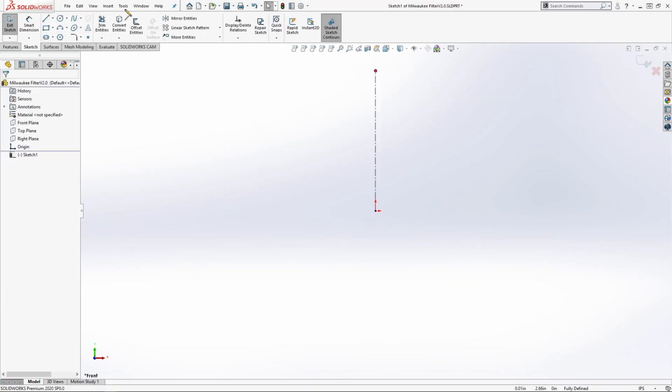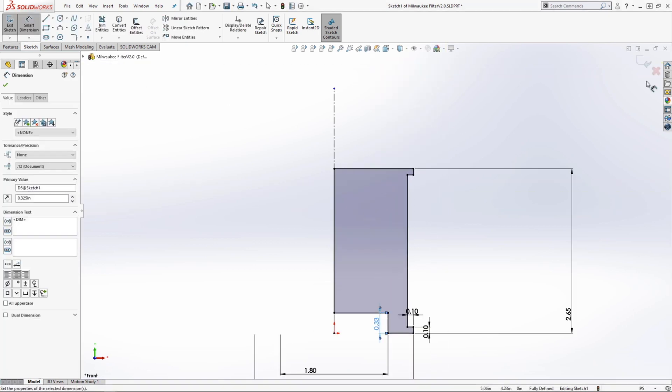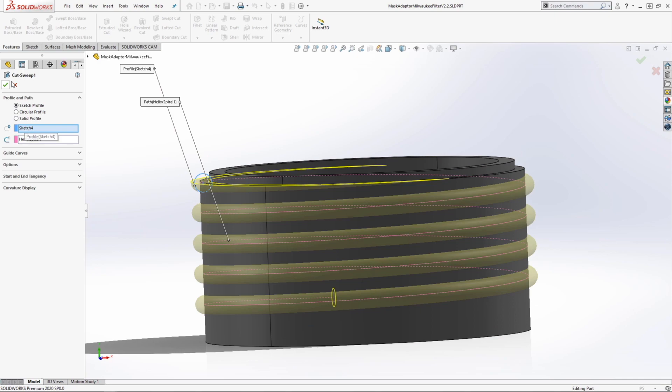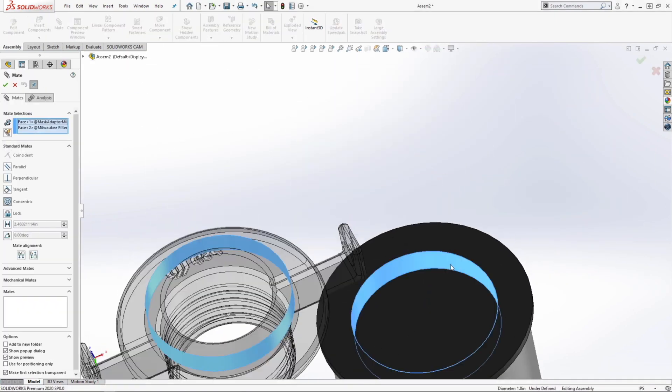We took the dimensions from an actual mask cartridge that they had and reverse engineered it in SolidWorks. From there we tested the thread, made sure it fit, and then tried putting a filter onto it. We gave it the geometry it needed and we got a working prototype that day.